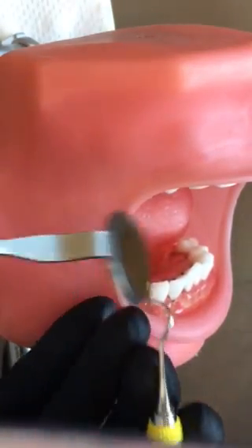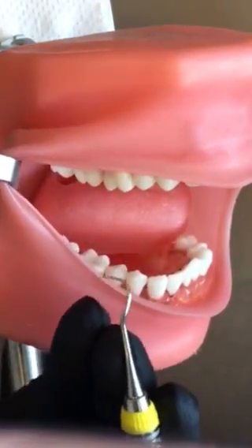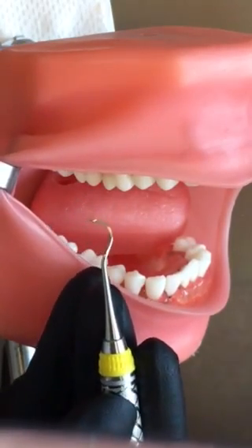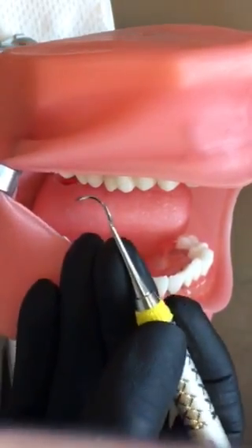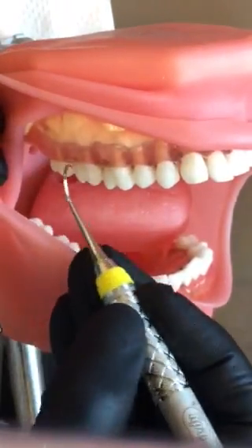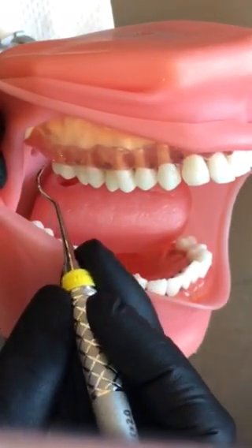Okay, maxillary. I'm going to retract the cheek. The patient is turned away from me because this is an area toward me. I'm sitting at 8 or 9 o'clock. I'm going to establish a fulcrum extra-orally. Pull the cheeks back so you can see, and start at the distal line angle — around, roll.